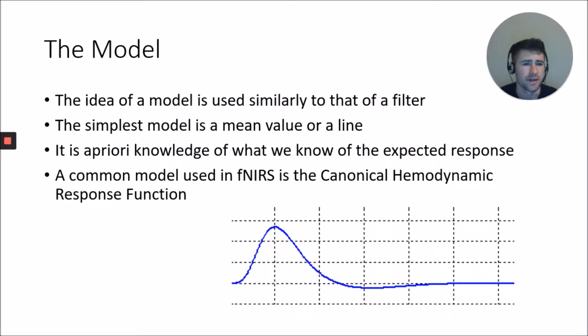I like to think of models as something of a filter, or also a mask, which I'll talk about in the next slide or two. A filter saying, okay, I have a circle here on, let's say, an image. I only care about what's inside this circle. I'm going to look at everything here, I'm going to ignore everything out here, I'm going to filter out all that.